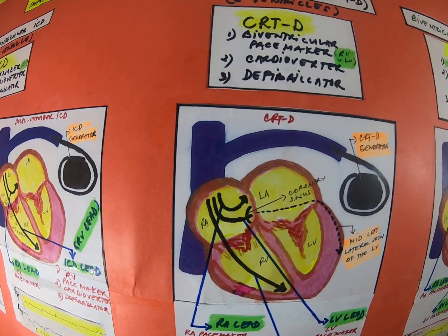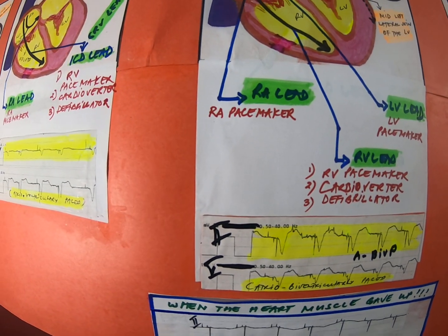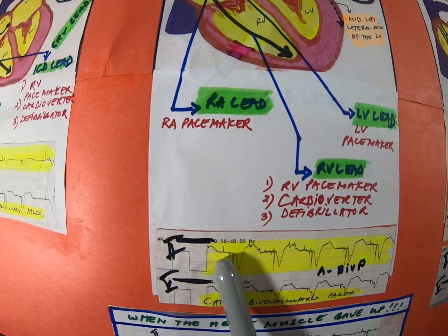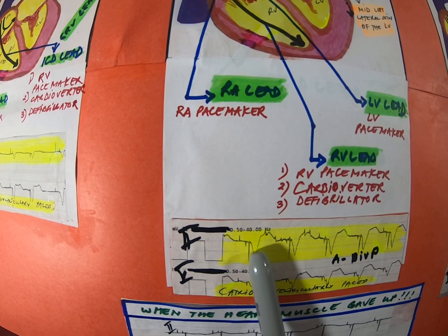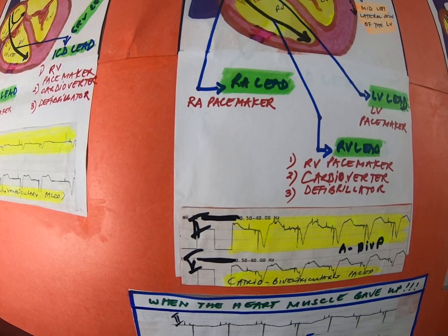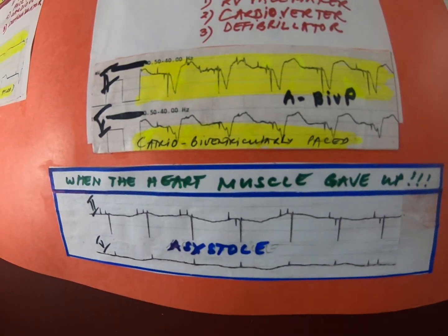So what does the ECG strip look like? Usually, in here is an example. We have here an atrial biventricular pace. You have here an atrial pace with depolarization, and we have two spikes before the ventricle. So we have here the two ventricles working well. Okay, and then the question is, what's going to happen if you see this?